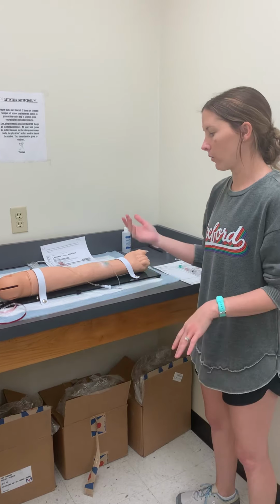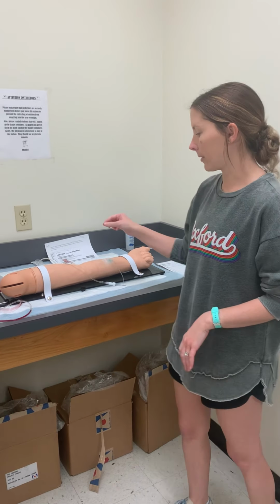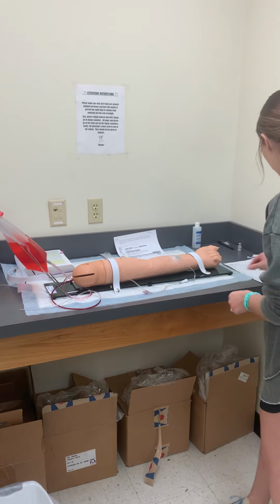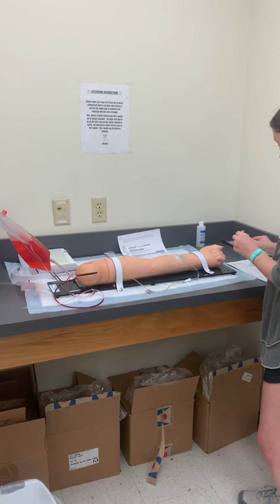Okay, next I want to identify the port that I'm going to be using for medication administration. The port that we're going to be using is the port that's closest to the patient, and that would be this one. So I want to clean my port.